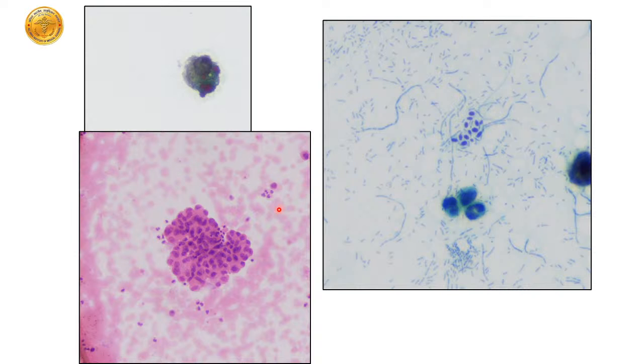Again, a slide to show you a degenerated urothelial cell. You can see these beautiful red inclusion-like round bodies in the cytoplasm. These are nothing but, anybody? I've already said what these are. These are Melamed-Wolinska bodies. Melamed was a pathologist and Wolinska was a cytotechnologist. Myron Melamed is no more.